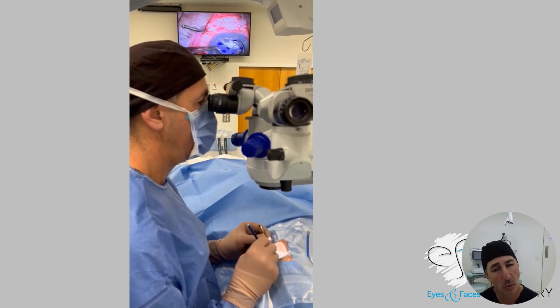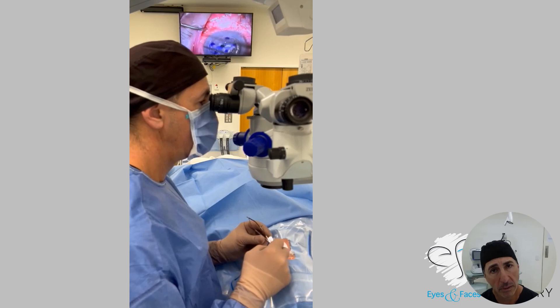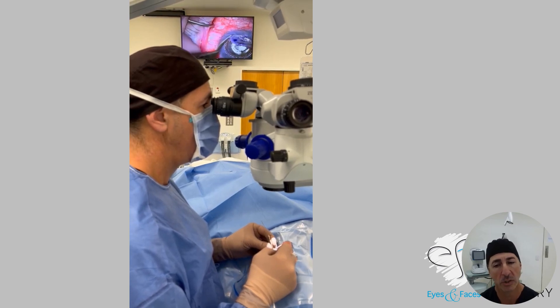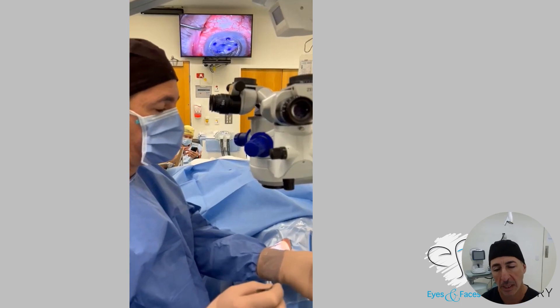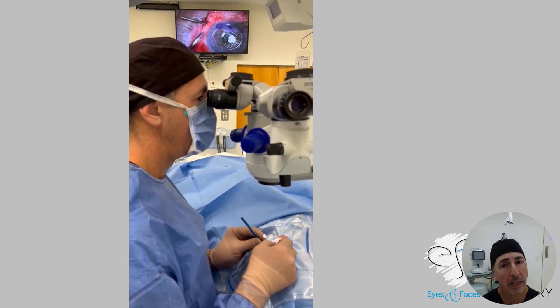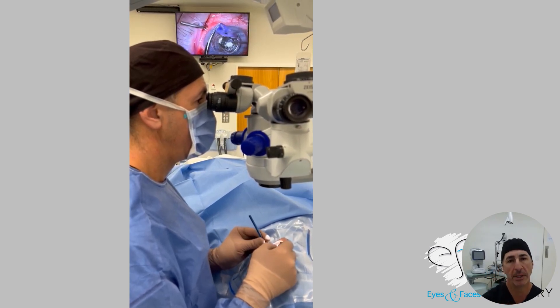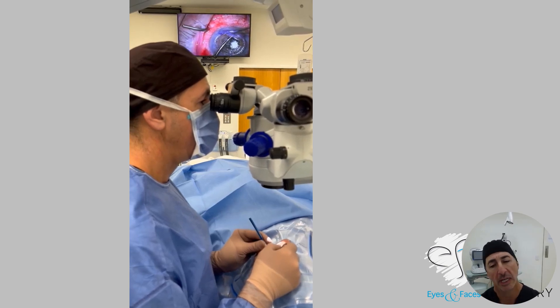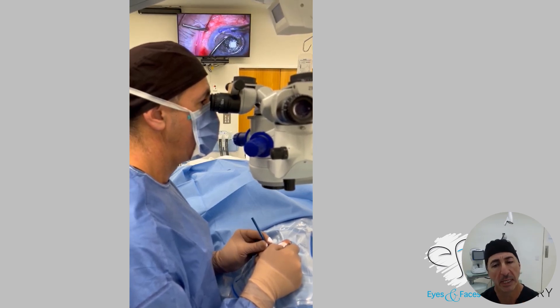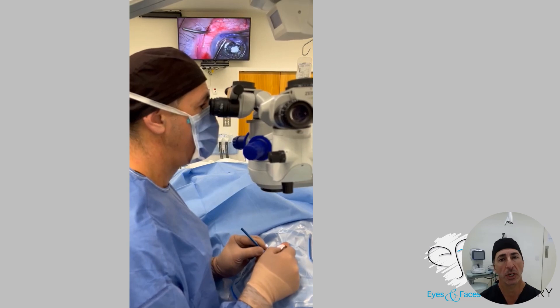The time passes quite quickly, even though this is a little bit sped up. You'll see me cutting off the edge of the tissue with scissors — it looks like there's big movement, but watch my hands and hardly anything is happening. Then I go back and continue the dissection. You'll also note I just changed hands, going from my right hand to my left hand. That's part of this state — you have to be very ambidextrous and use both hands for this surgical procedure. It's very hard to do with just one hand.